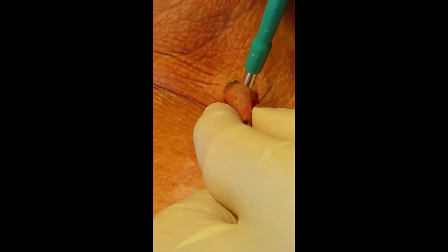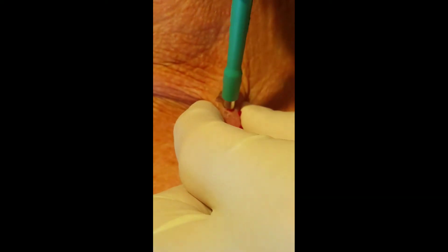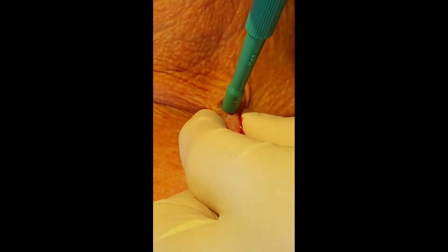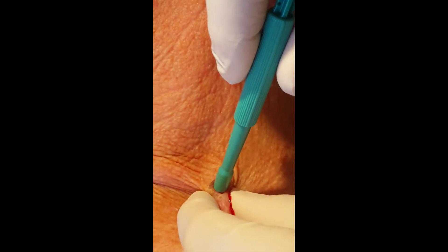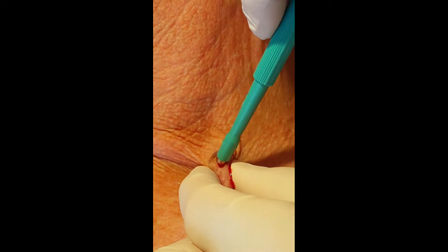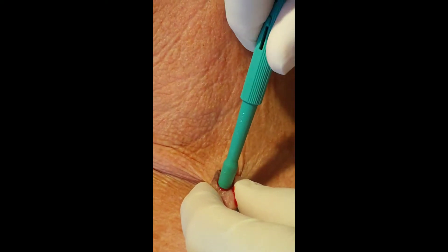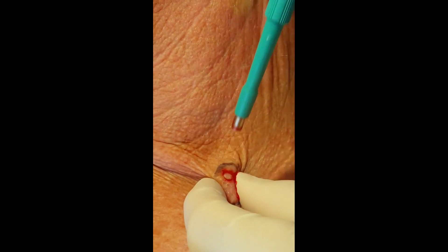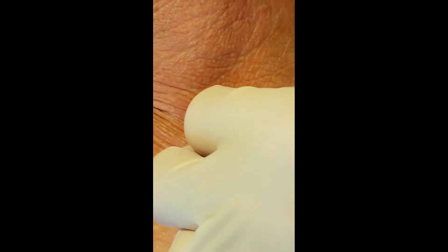Pinching the skin up, we then rotate and push the biopsy into the skin. The biopsy is done; however, one extra thing that can be done is to remove — tilt to 45 degrees and reinsert — which will transect the fatty base. That allows the piece of skin to be removed.